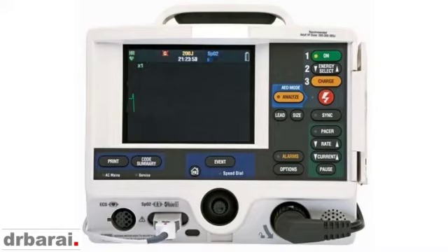Now, let me show you some other interesting cases that you can pick up in the defibrillator machine. This is a 56-year-old gentleman who had a syncopal event in the shopping mall, and he was brought in by ambulance straight to the resuscitation cubicle. We connected the patient to the defibrillator machine, and we found this rhythm. What you can find here is a QRS complex, a P wave, QRS complex, a P wave, QRS complex, a P wave.